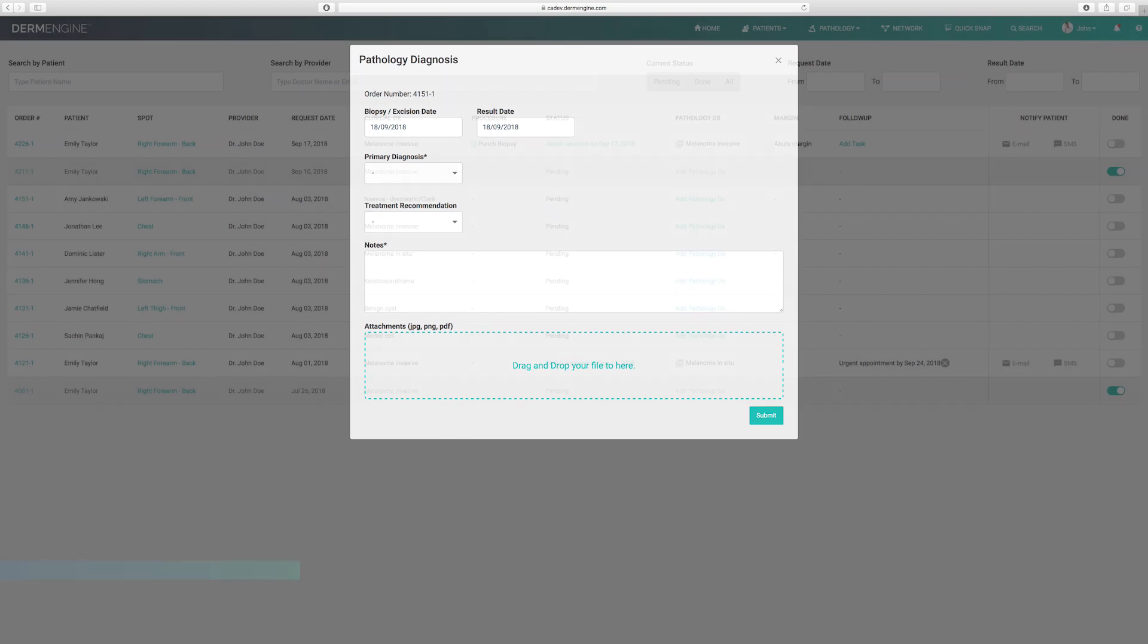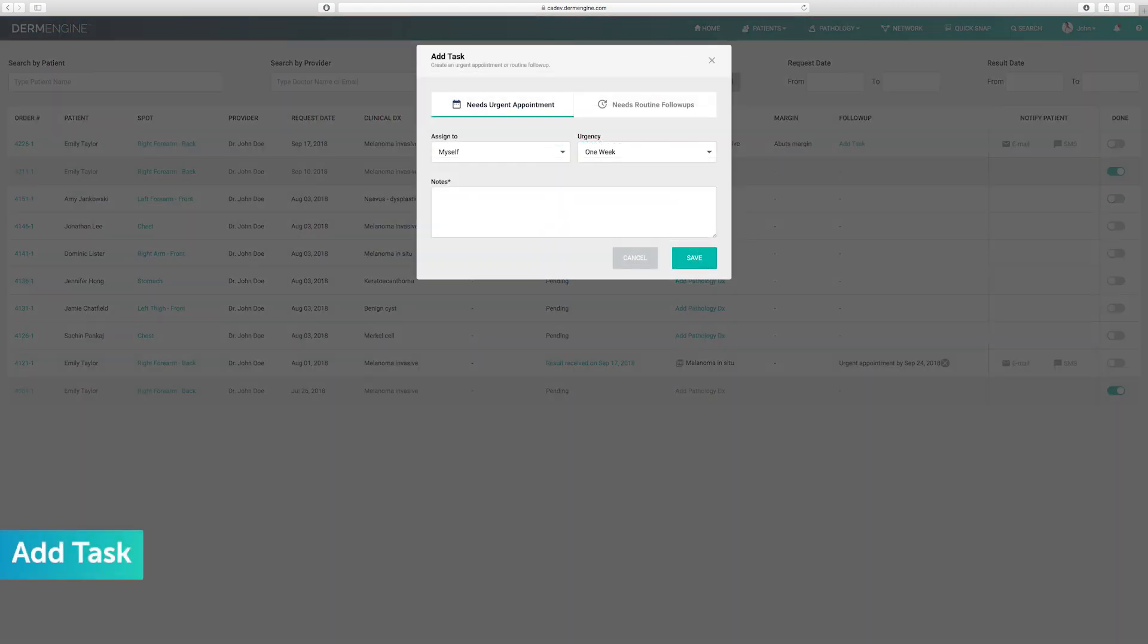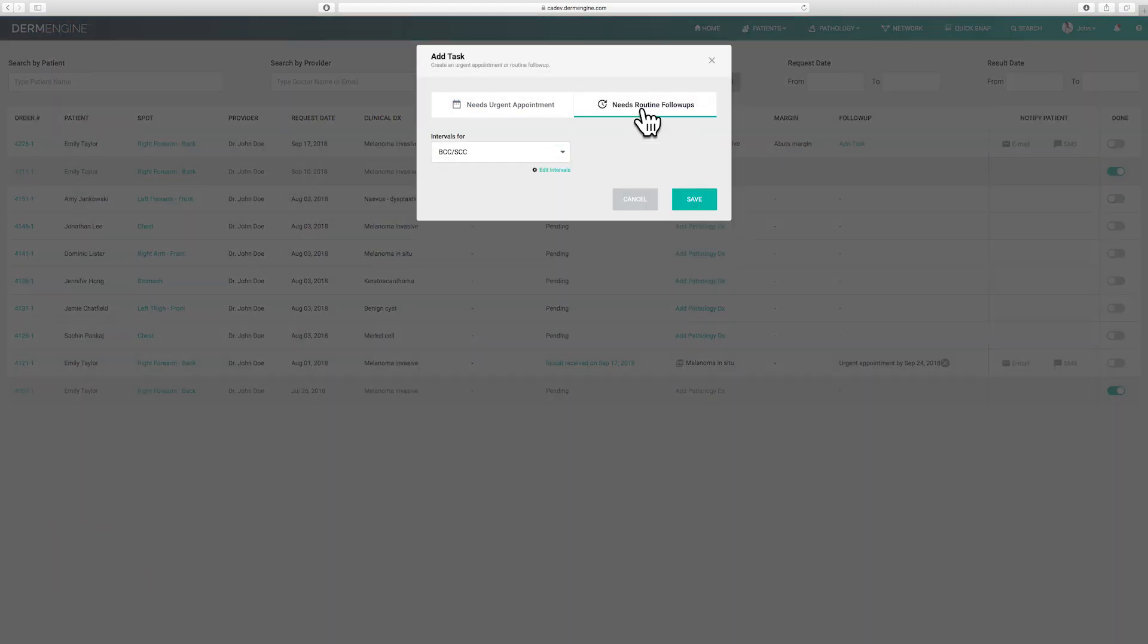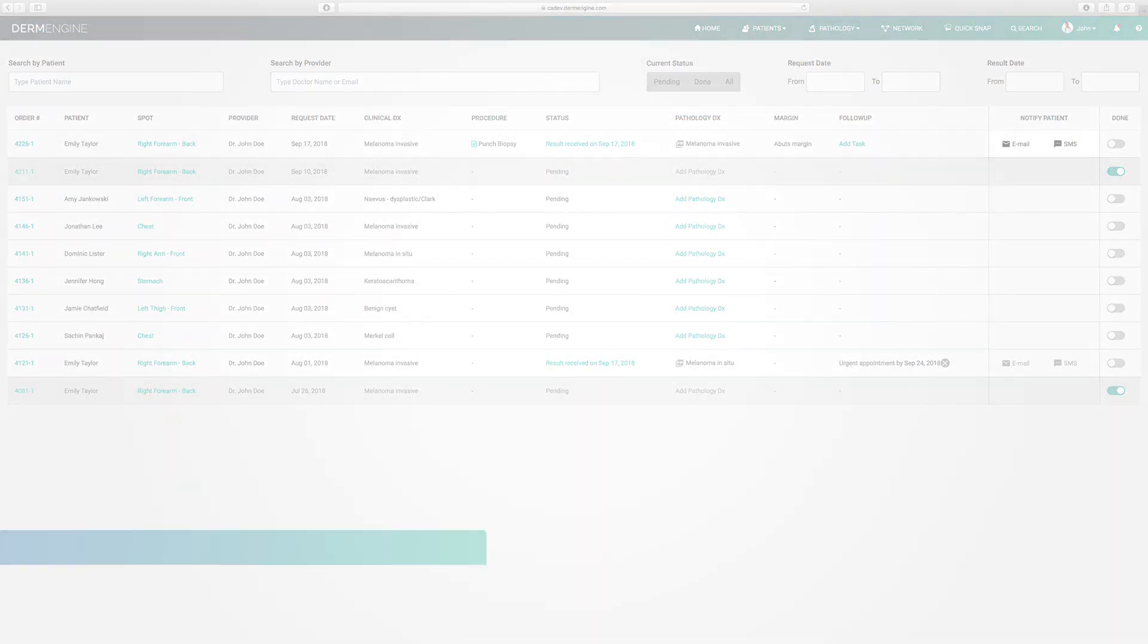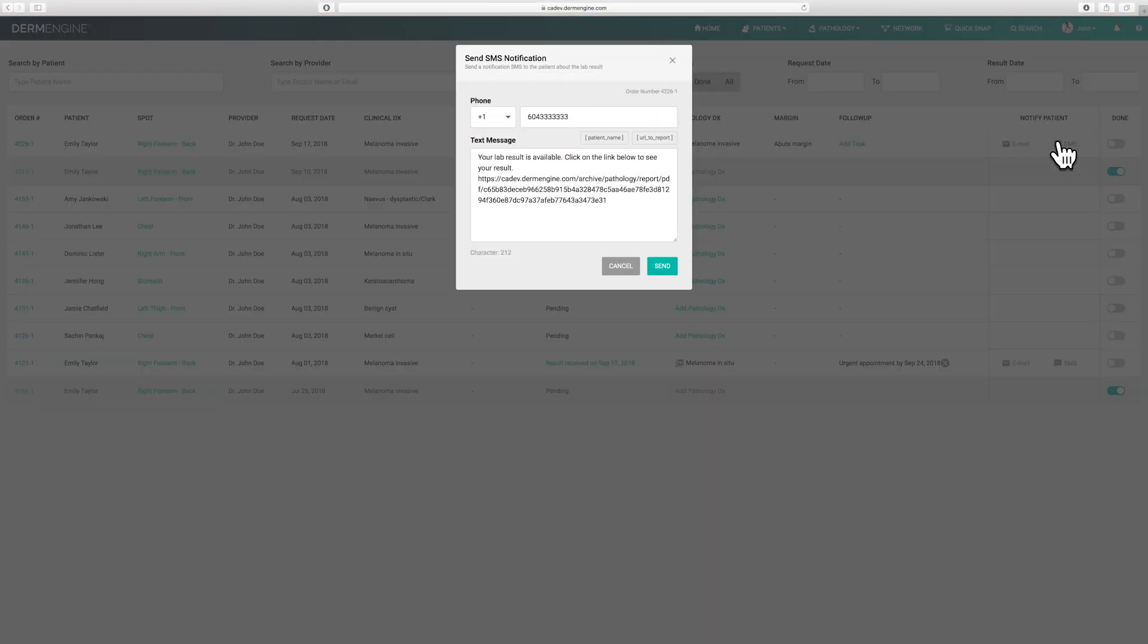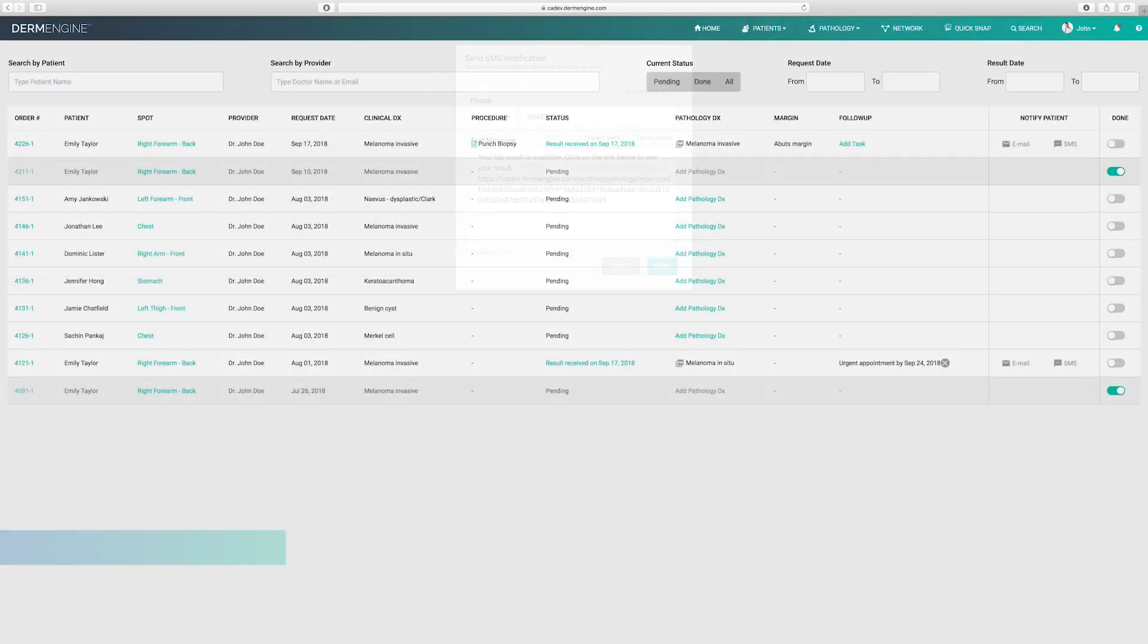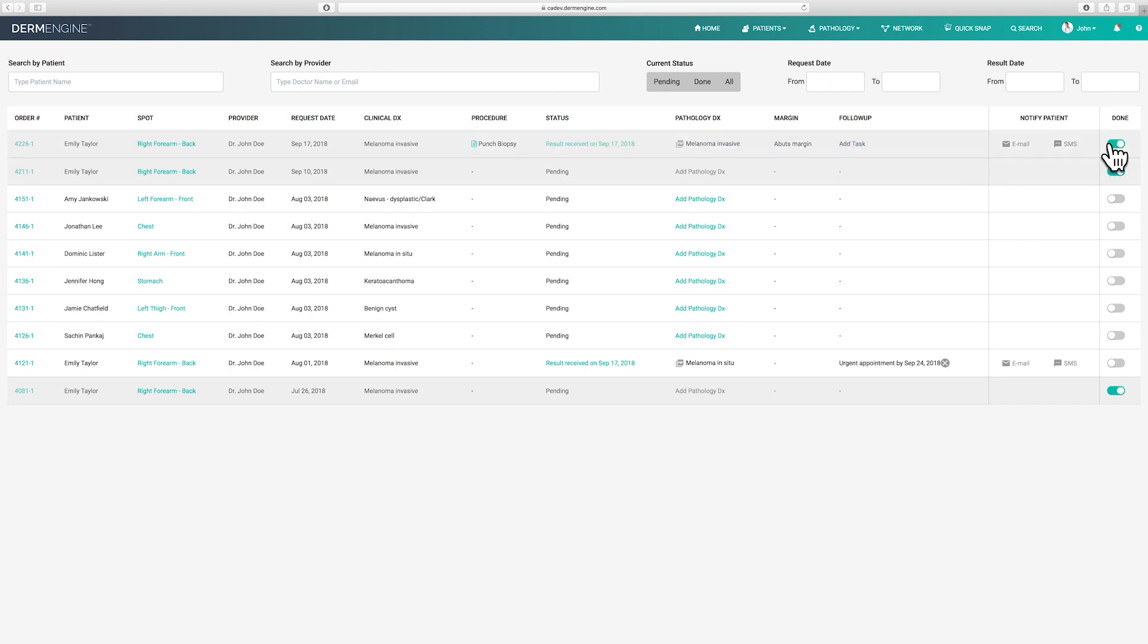Once complete, you can schedule an urgent appointment or a routine follow-up by pressing the add task button. You can conveniently notify your patients that their reports are ready for review. By choosing the SMS or email feature, you can type your message directly from your computer for quick and easy communication. If a case is complete, you can mark it as done to fade that row to help organize your pathology inbox.